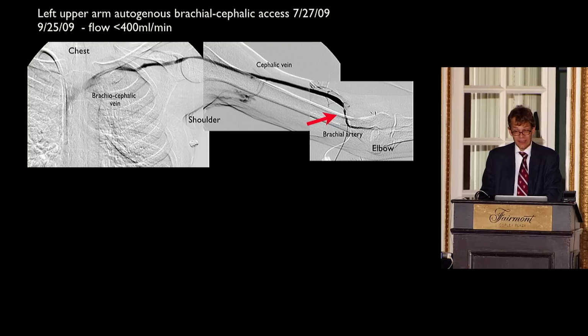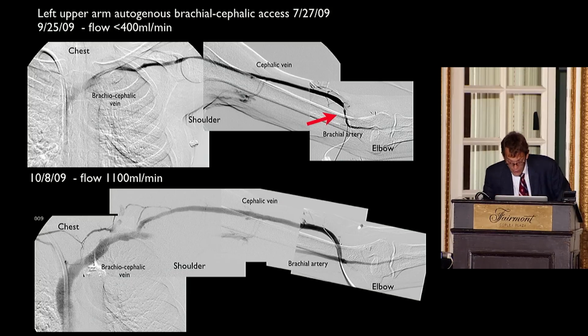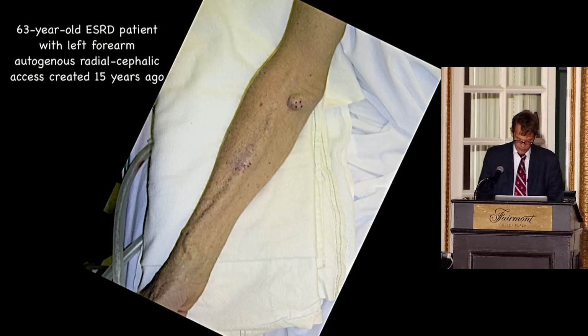We do an angioplasty and get the patient back a few weeks later. And you see the angiogram shows that under the right flow, the vein is immediately larger, the flow is 3 times higher. Now listen to this. So this is much more like wave-like flow on the beach. It doesn't stop. Yeah? So this is what you want to find. If you get the other pattern, well, then you have to figure out, do you want to intervene? Where do you send the patient? What's the timing after surgery?